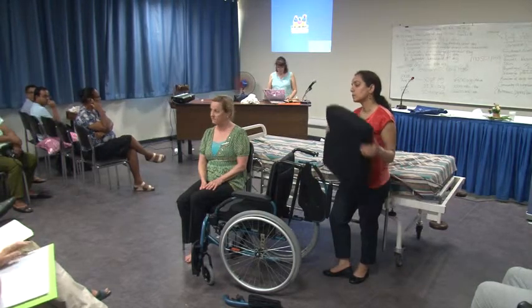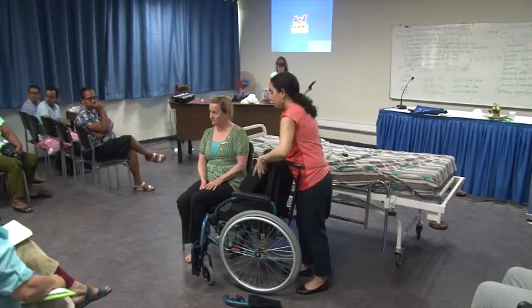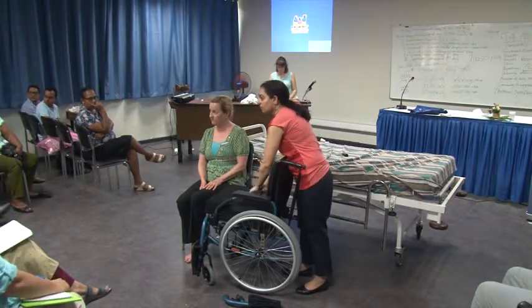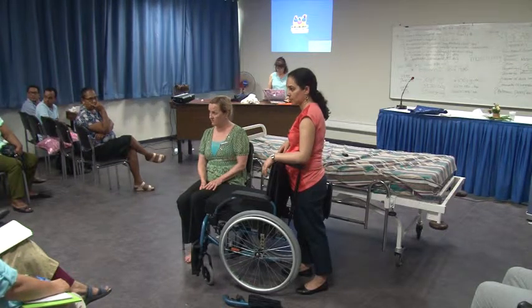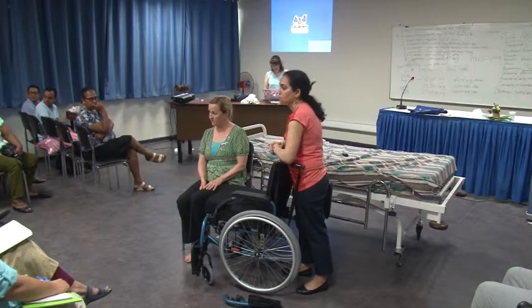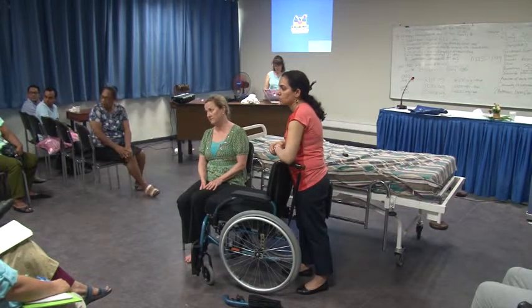You know, I bought one. I used to put it on my son's wheelchair, and then I'd tell him you have to stand first and then we'll lift you and put him in the chair. The issue is none of my mother or my wife is wishing to use it because they have to lift further. It makes the chair high. Right. That is one of the things. Yes, it does make the chair high for transfers.